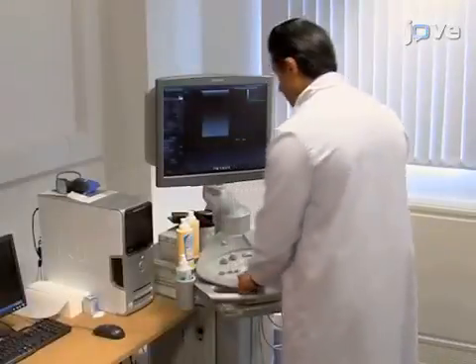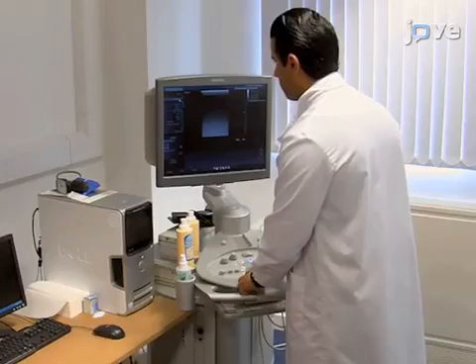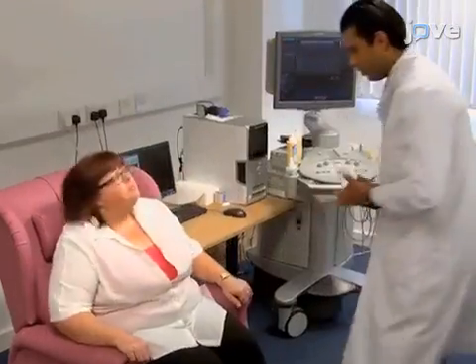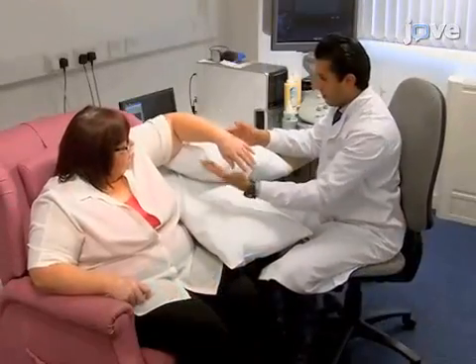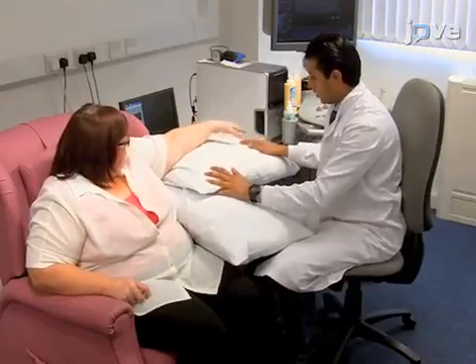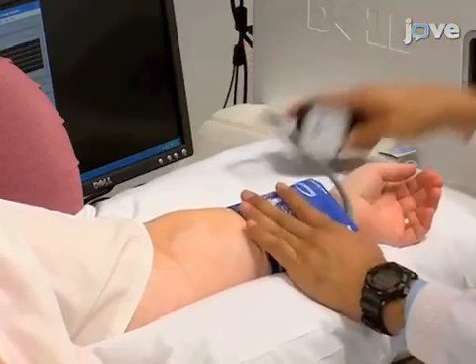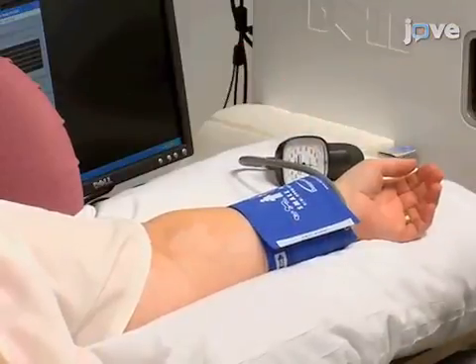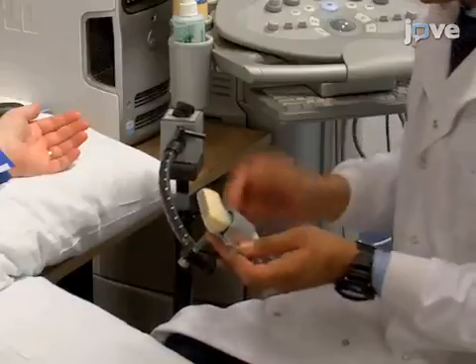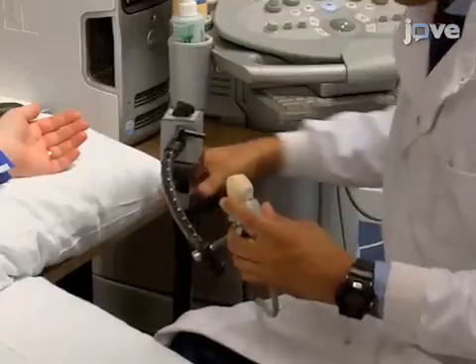Begin with setting up the Doppler ultrasound machine and live imaging vascular image analysis software. Then introduce the participant to the setup and have the participant relax in the chair. Ask the test participant to remove any jewelry from the wrist and use a pillow for them to rest their arm comfortably. Then put a blood pressure cuff around the participant's wrist — it must be held as still as possible. Next, secure the linear transducer array from the machine to a stereotactic clamp and tighten the clamp on the transducer.